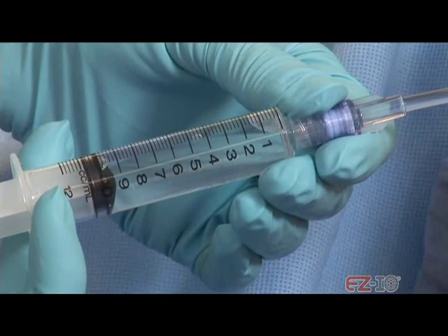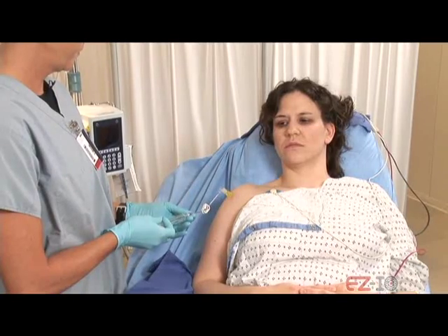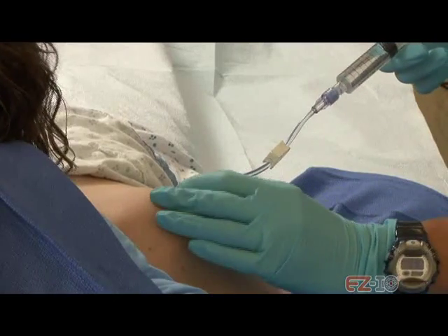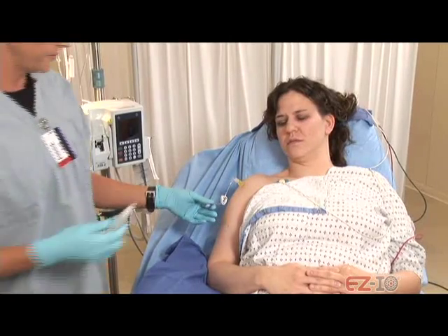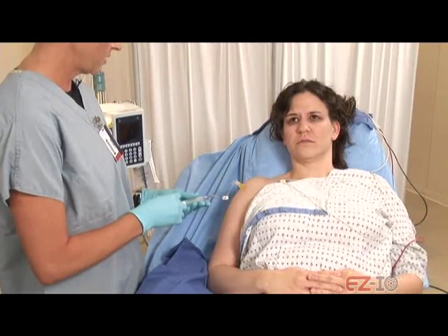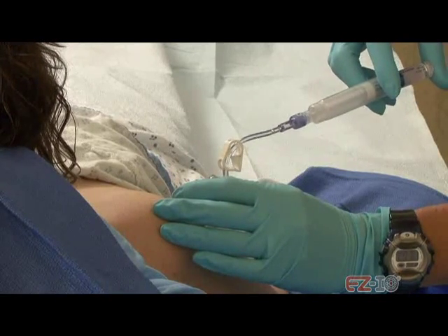I'm going to go slow again — I want you to tell me when you're not feeling pain. If the patient is alert or responsive to pain, prepare them for intense pressure associated with the bolus. The rest of this is going to have to go in pretty quickly — it's going to take about 5 seconds, so I'm just going to count you through it. Are you ready? Administer 10 milliliters of normal saline very rapidly over 5 seconds or less. Note that the pain will end almost immediately after termination of the flush. Flush is required to get good flow — remember, no flush, no flow. You should then follow with additional lidocaine as protocol allows.